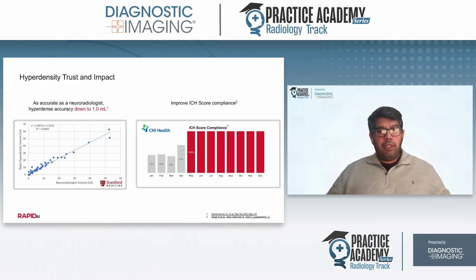So in this first graph here, we see neuroradiologist volume. Board certified neuroradiologists were asked to draw circles around where they thought the hematoma was. Then the Rapid hyperdensity did the same thing, and the accuracy for the Rapid module was down to 1 milliliter. So it is an extremely accurate way of calculating hematomas.